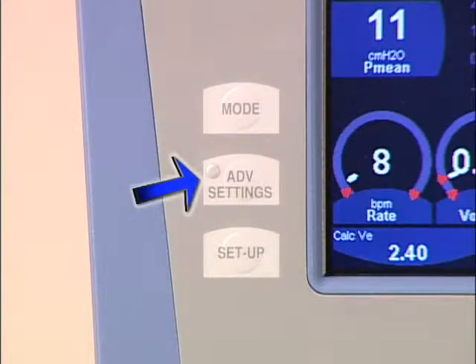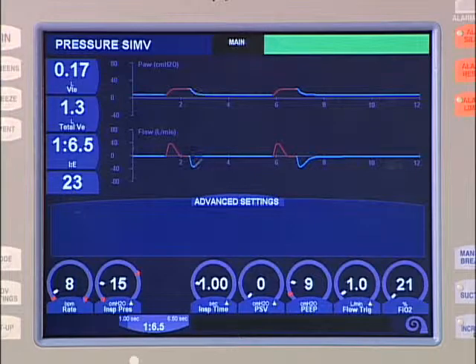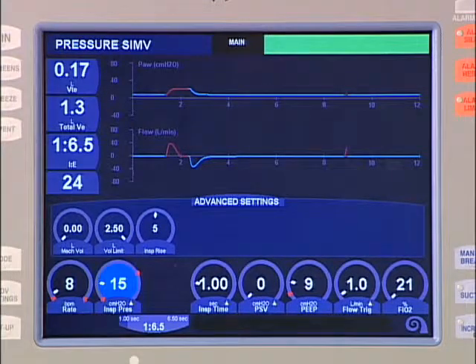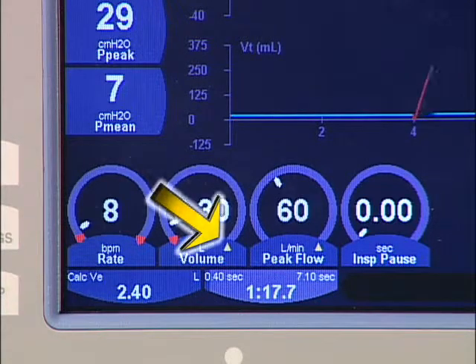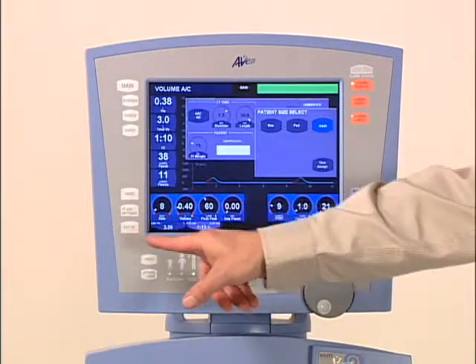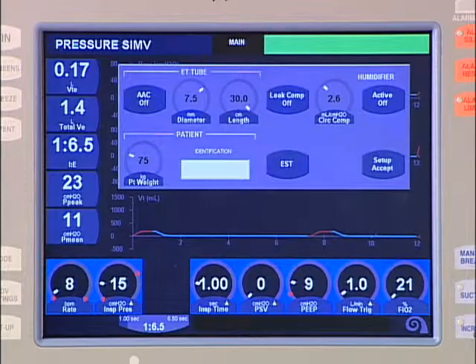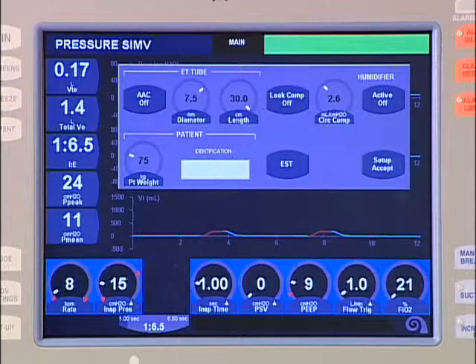The advanced setting button allows the user to fine-tune certain ventilator settings for more customized breath delivery. Advanced settings are logically associated with particular primary controls. Primary controls with advanced settings have a yellow triangle indicator. Advanced settings will be detailed in another presentation in the AVEA Ventilation System series. The setup button allows the user to access the setup screen, where the operator can select or activate certain functions such as active or passive humidification, artificial airway compensation, and patient weight entries. The extended systems test, or EST, can also be accessed and performed at any time from the setup screen.